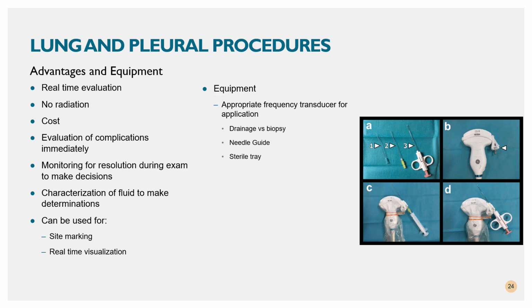So you guys as practitioners are probably used to putting a lot of needles in things. In the sonographic world, we talk about finding pathologies and evaluating to the best of our ability. And because sonography of some pathologies can be very vague in appearance, most of the time they're going to put a needle in it. So in this case, this is your chance to put a needle in it.